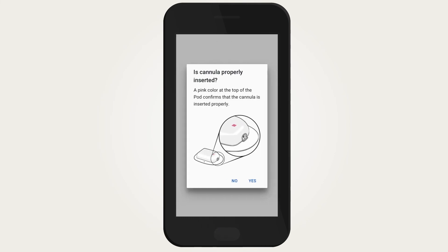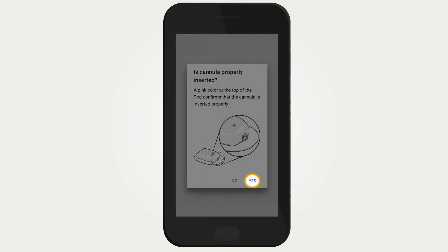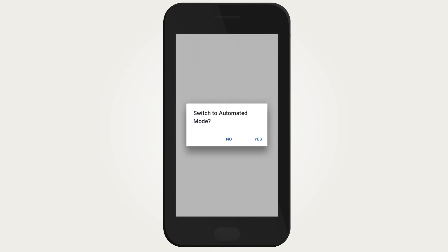Confirm that the pod is securely attached to the body, then tap 'Yes.' After insertion of the cannula, check the pod and infusion site. Look through the viewing window to verify that the light blue cannula is inserted into the skin, and verify that the pink color is in the area indicated on the top of the pod. Tap 'Yes' if the cannula was properly inserted.